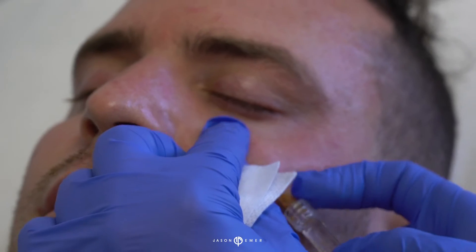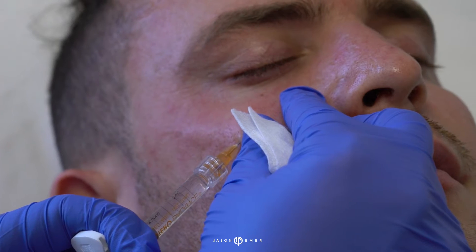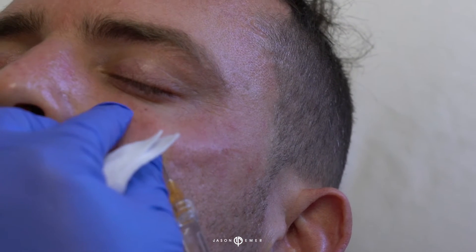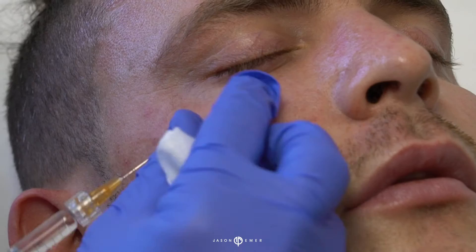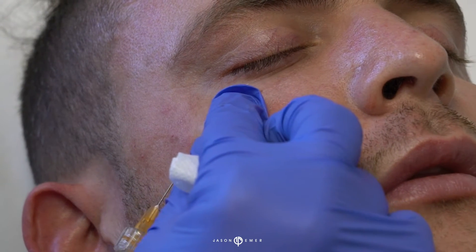We're going to go to a small amount of his under eye — you can see where the cannula is. We're just going to give him a little support here. This filler, which is our softer filler Bellatero, I like here because it's very, very soft and natural looking. You never want to forget the lateral edge of the eye because this area gets hollow too.